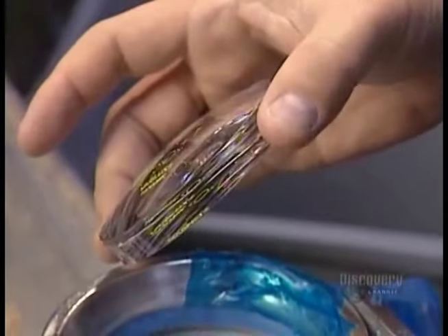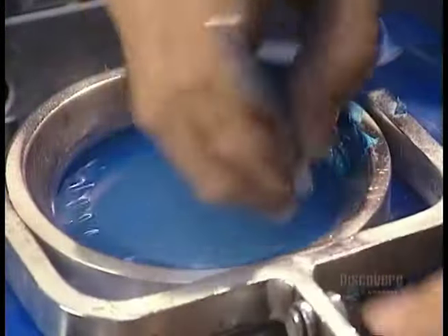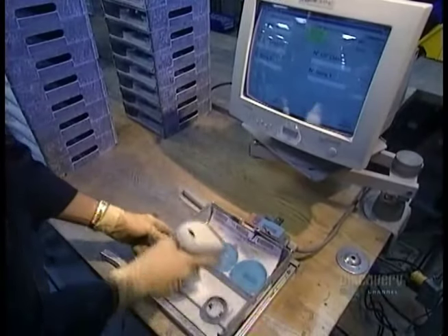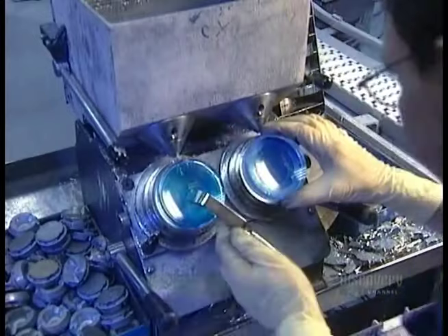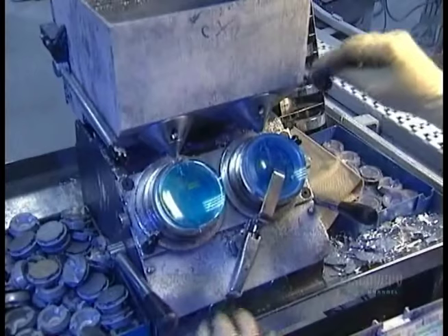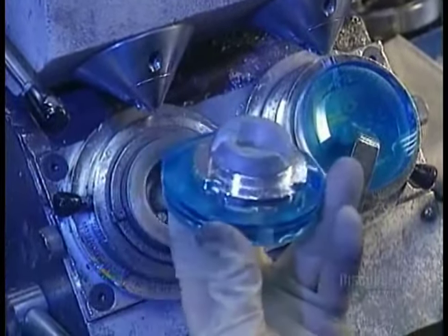Eyeglass lenses start out as large plastic discs. The first step is to place a protective film over the convex side, so it won't get damaged while the lab works on the concave side. With a scanner, they retrieve the customer's prescription from the central computer, then program those measurements into the tray holding the discs. Next, they heat up a mixture of seven metals to 50 degrees Celsius. Any hotter would melt the disc on contact. Out of that molten metal, they mold an attachment. This allows the disc to be mounted on a machine for tooling.